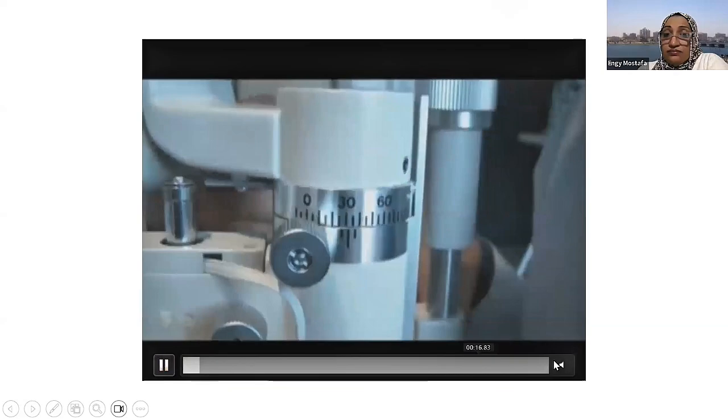While most of us use the peripheral method, which is the Van Herick method, we narrow the beam at 60 degrees and align the beam vertically. Let's take a picture, take a video about it. Here it is around 60. And of course, we go and try to go to the limbus and focus on the limbus, without decoupling, of course. We are coupled as usual, and we are looking at this image.